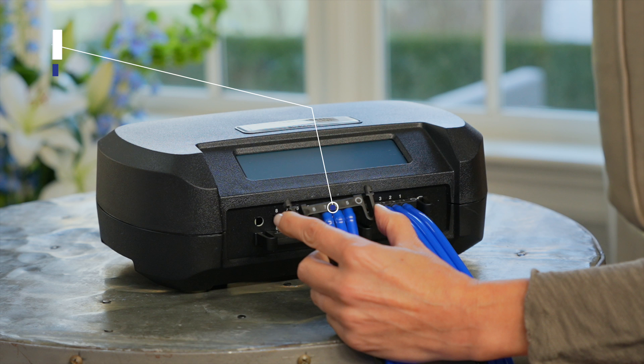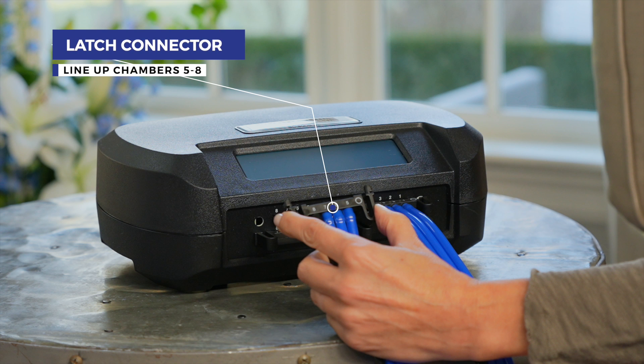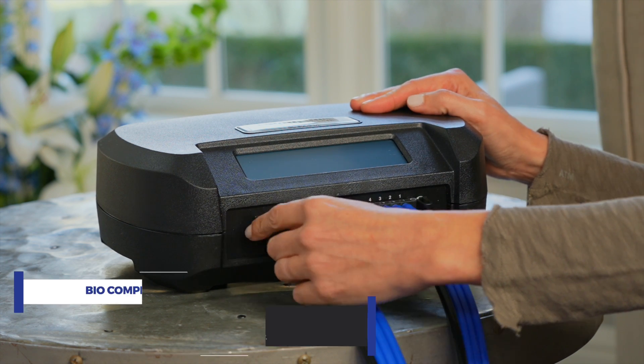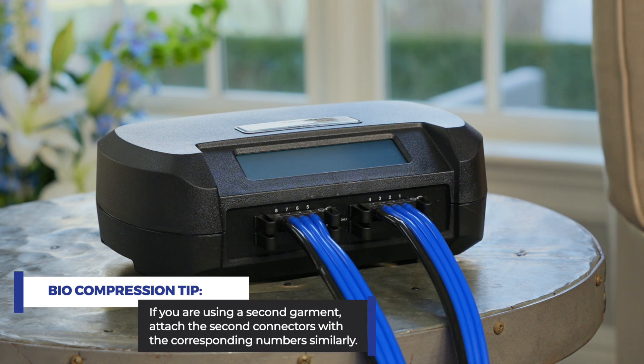Then line up the second latch connector, chambers five through eight, and attach the same way. If you are using a second garment, attach the second latch connectors in the same way.